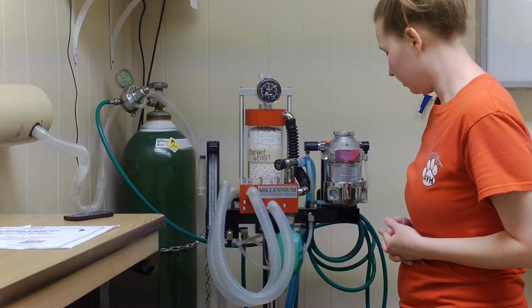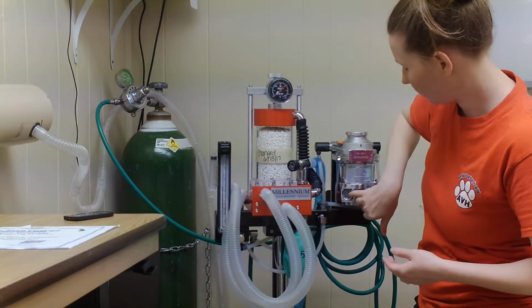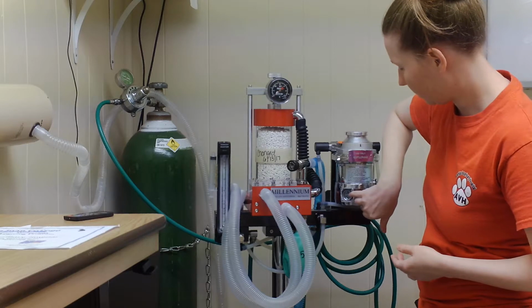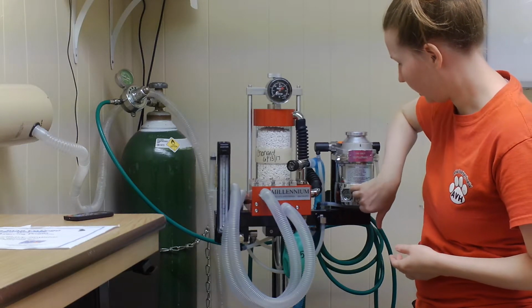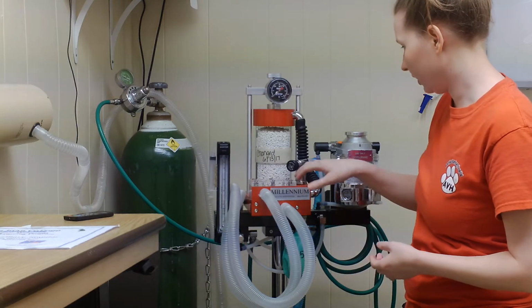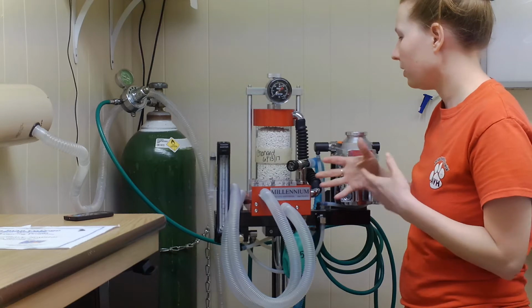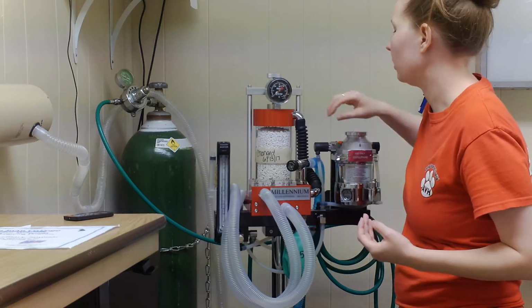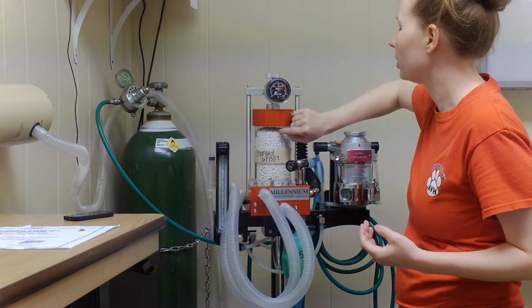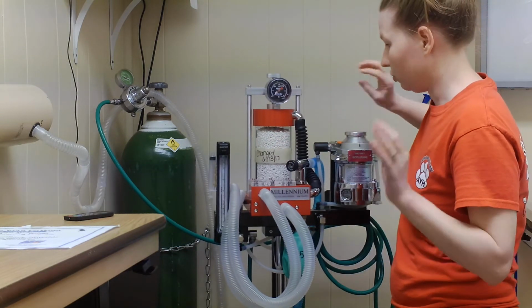But that is how you prepare an anesthetic machine. You can see here also that this gauge says that we have plenty of isoflurane in our vaporizer. But other than making sure that your Sodasorb is good and it's not turning purple or anything like that, like I said, if you have any questions about when the last time it was changed, or whether it is still good, just go ahead and change it.